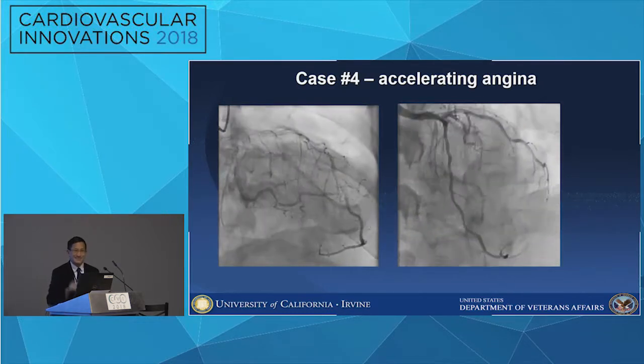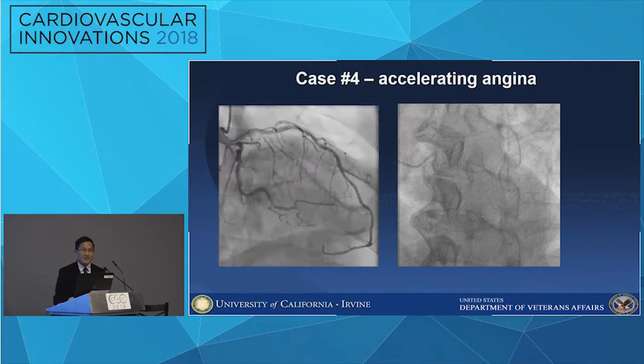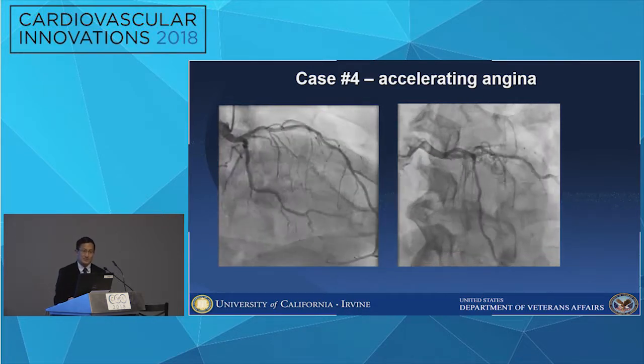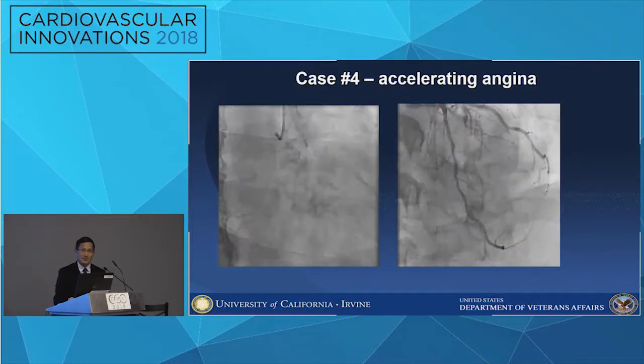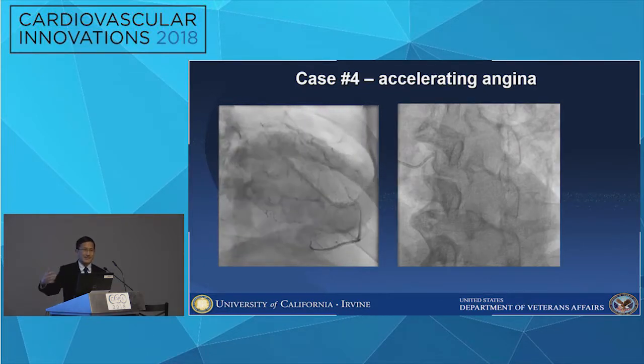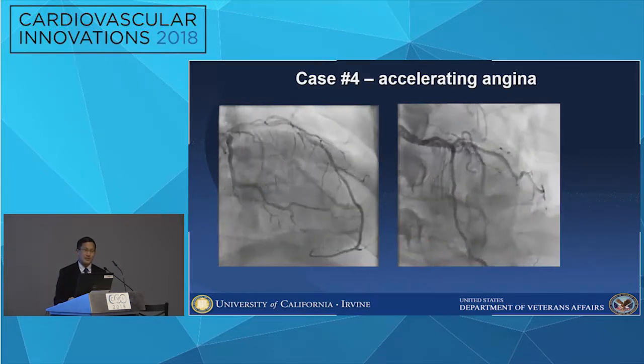Any questions? Using nitroglycerin prior to any of your measurements? Yes, absolutely. You should try to use nitroglycerin before all your measurements because it reduces wire spasm. All these wires will potentially cause spasm. I use it at least half the time. Usually the patients I don't use it in are people who are already hypotensive.